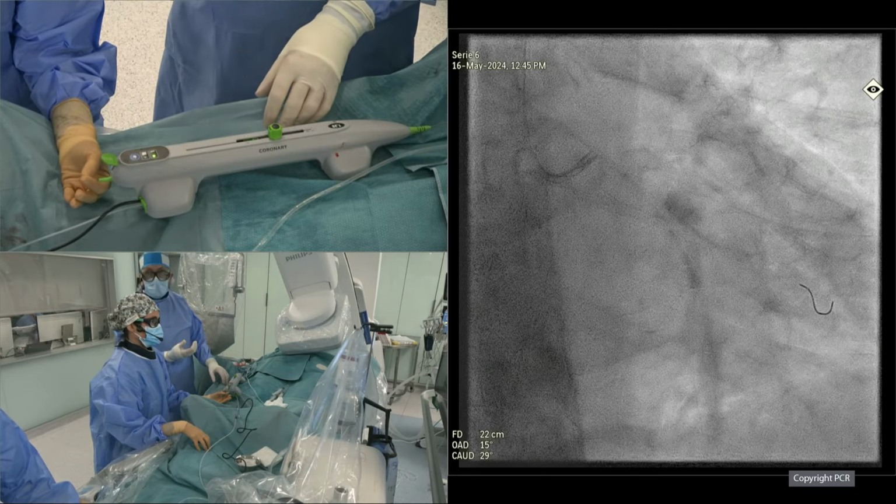Nieves, as agreed, we are going to perform more ablation, but always backwards. So let's repeat it to advance. Let's go for glide assist, and you need to help me again to cross this angle. I'm holding the wire with a little bit of tension.